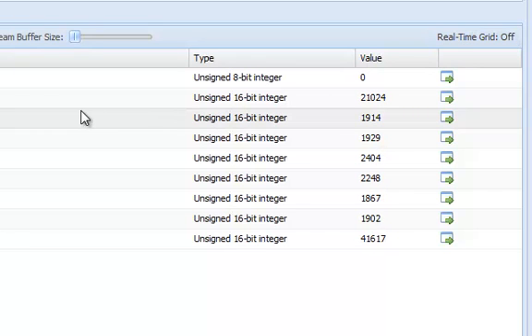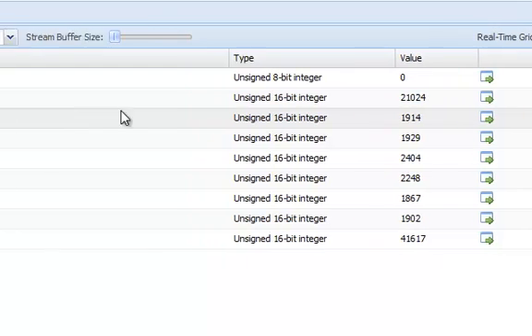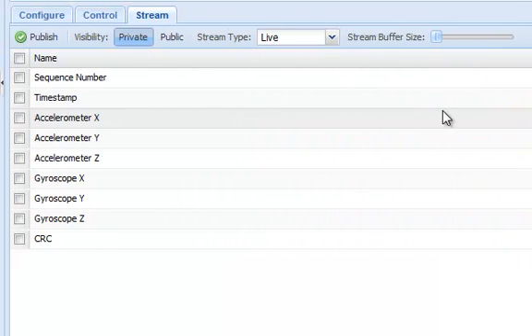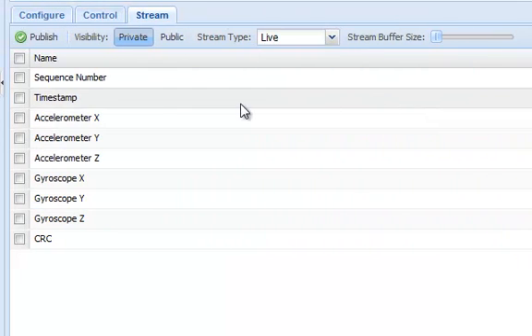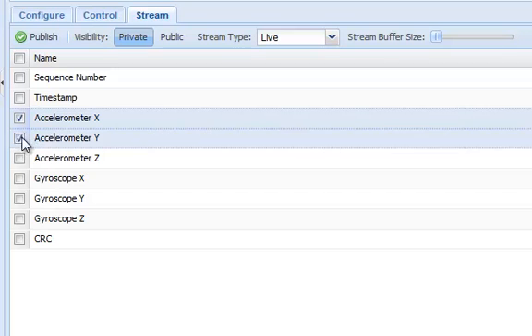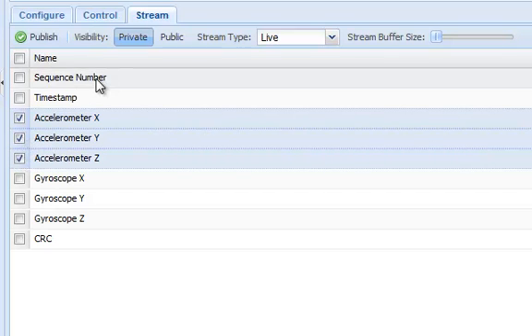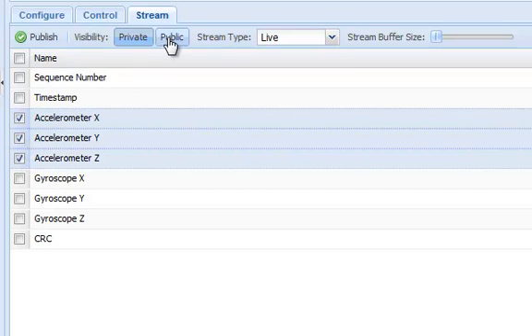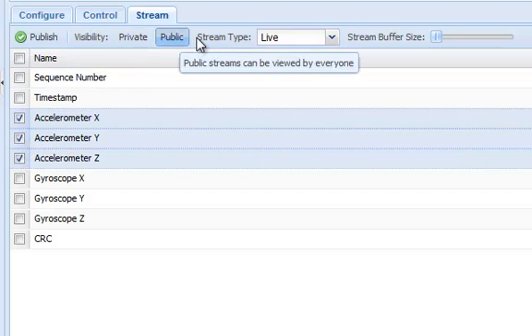To publish data live over the internet, I can, for example, select the accelerometer variables, as well as a stream type, and click the publish button.